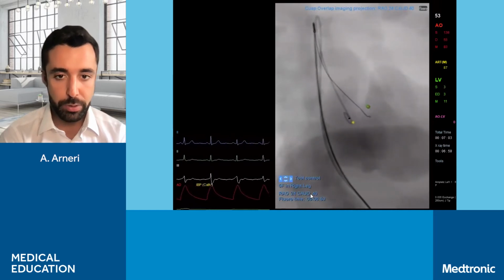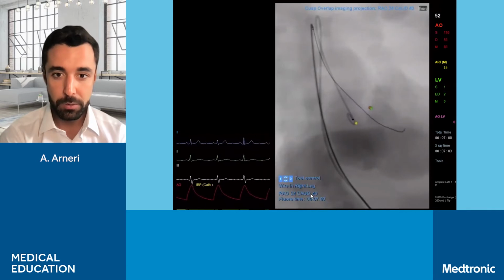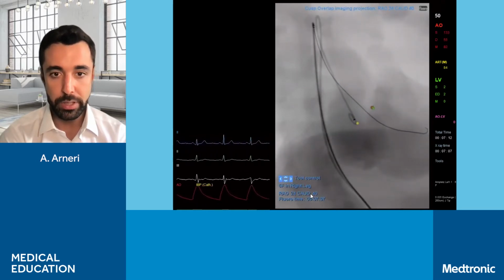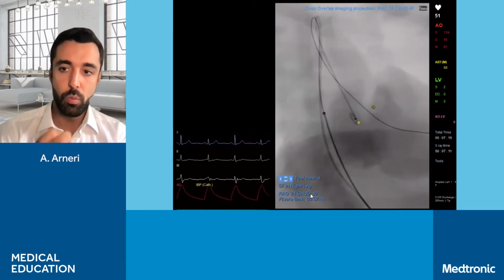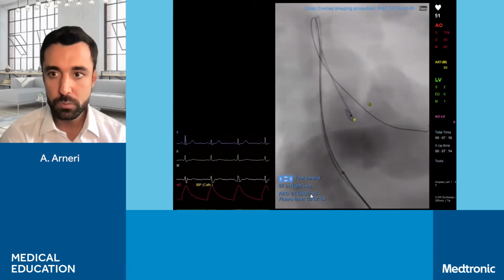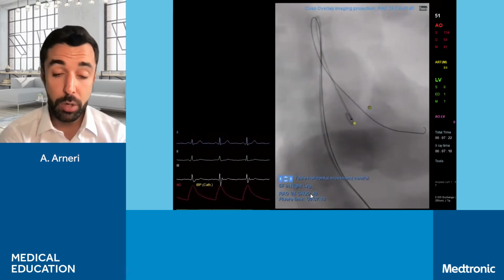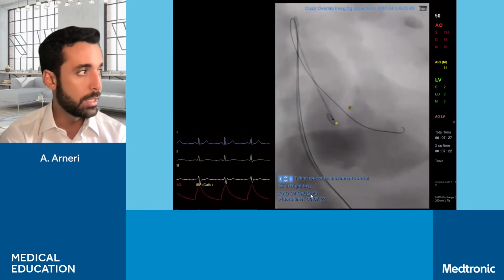Okay, here it is really important to make sure not to lose the ventricle, so pushing on the wire. It's really important here because while you're pulling back the AL1, there's a risk that also the wire comes out. At this point, as I mentioned before, we need to exchange for our pigtail. So now we're going to select a pigtail.